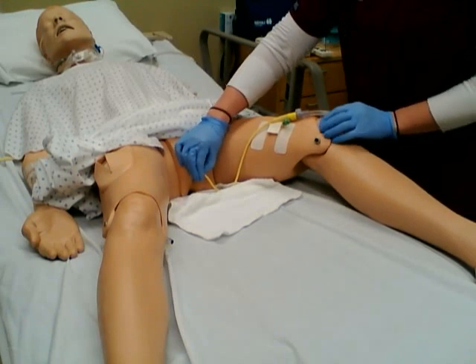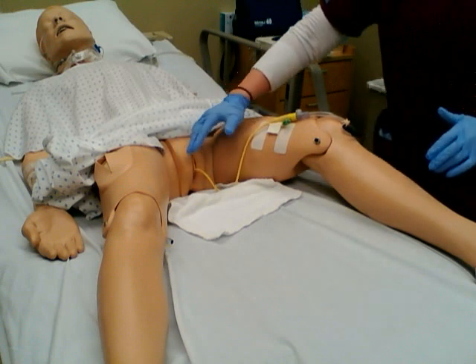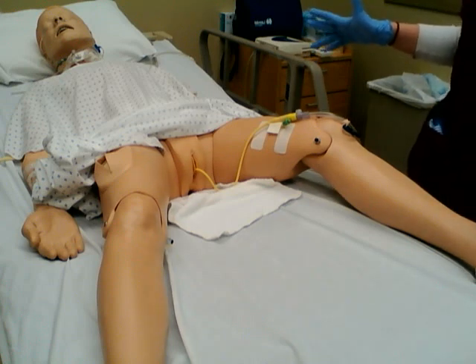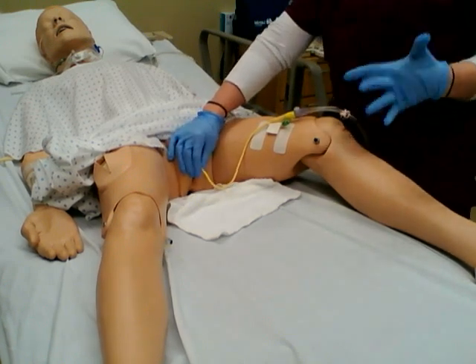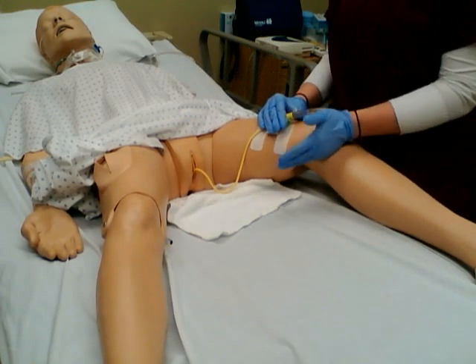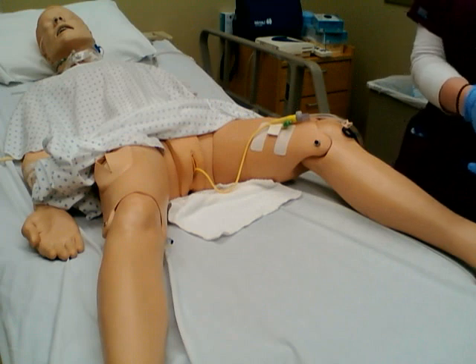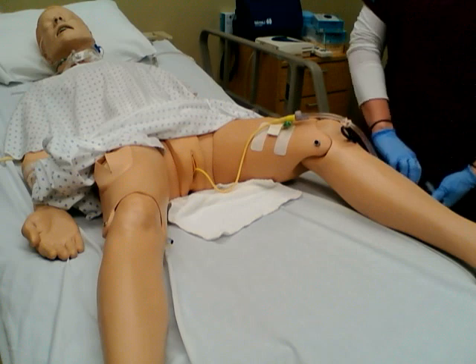Okay, so then I want to get the syringe that I have after I pinch. Okay, with the syringe that I accidentally threw away already, you would check your notes and make sure, from the nurse who put it in or yourself, how much water was put into the balloon. You need to make sure that all of that balloon is completely empty of water. You can't have that in the patient when you pull it out, otherwise it will be extremely painful.